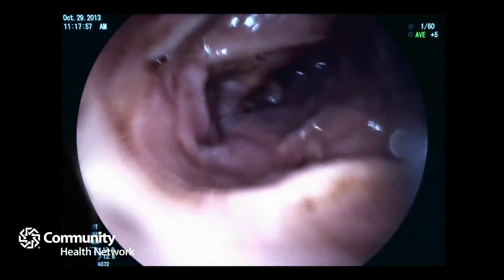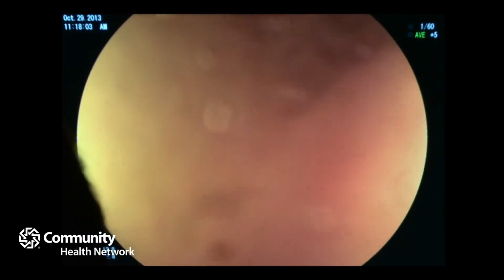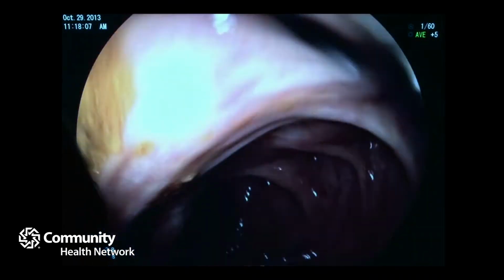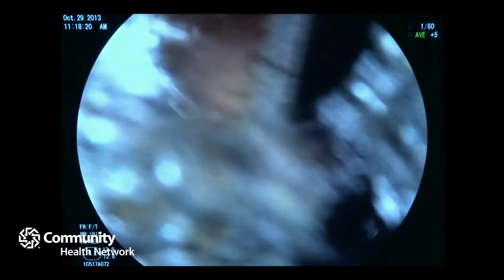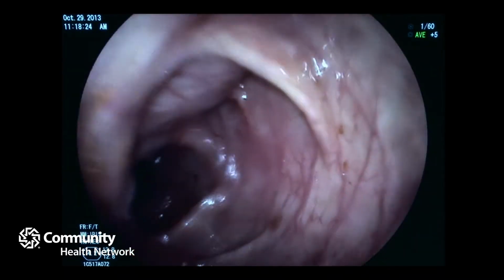And there's a lot of different preps. They're not like the old days where people always had to drink 8,000 liters of stuff. There's low volume preps. There's pill preps. So that should never again be a reason to not do it. But as you can see, I have a view, but I can't always see behind the folds. That is a limitation. We accept that as a society with manufacturing and gastroenterology, we're trying to improve that.